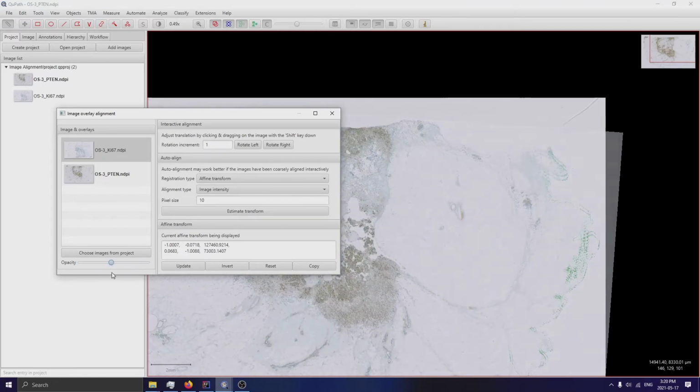The discrepancy you see here is the result of local deformations, and that might require deformable image registration techniques that are not available within QuPath, but do exist in some of the more recent publications, and other histology platforms such as Visiopharm. There's a MATLAB script I'm working on that does deformable image registration on a GPU, and I think someone wrote a plugin for ImageJ or something that'll do this.